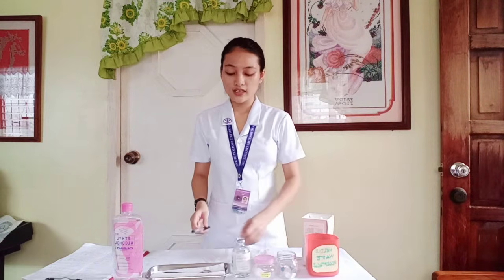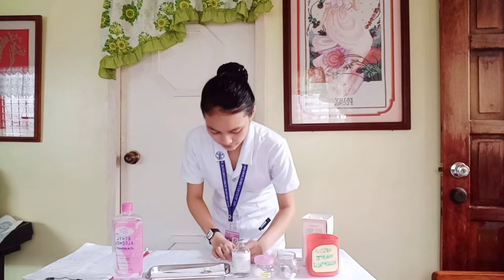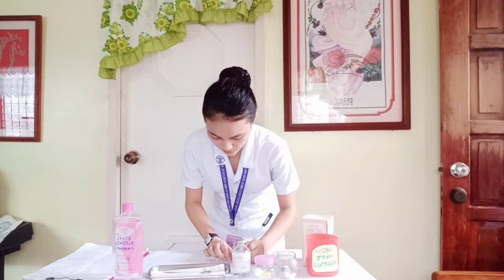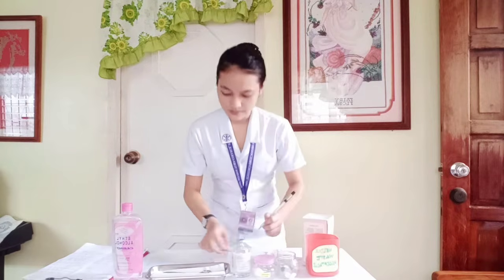Also, do not forget to write the medication ticket, the name of the drug, the dosage, so that we won't forget what medication was drawn into that syringe and we won't get confused.